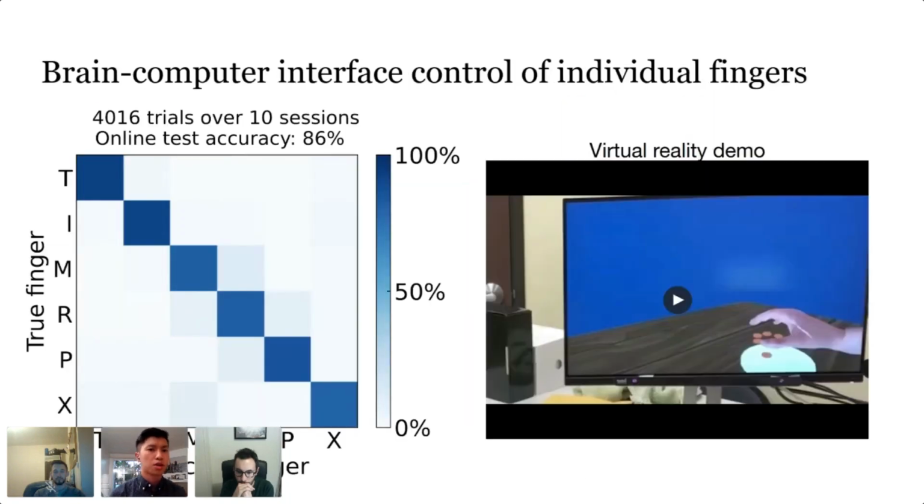So using the same idea, we then mapped neural activity to finger movements in session so our participant can control a brain-computer interface. So each trial, the participant attempts to tap a finger, and then their attempted movement is now decoded. And using only a short calibration period for the classifier, the participant is able to use that to accurately control individual fingers of the BCI.